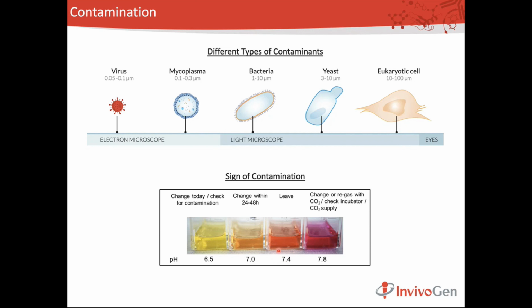So for example, if your medium looks like this, you can leave it alone. If it looks like this, then you have to prepare for medium change. And if it looks like this, then you have to check for contamination. So this is the sign of contamination.